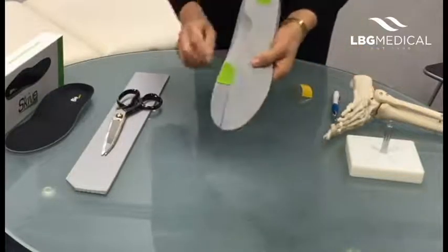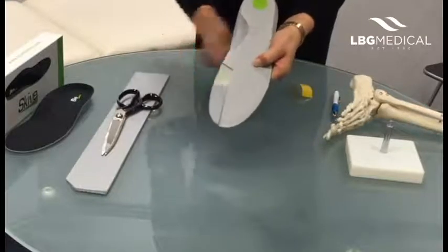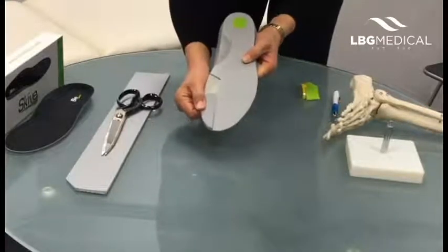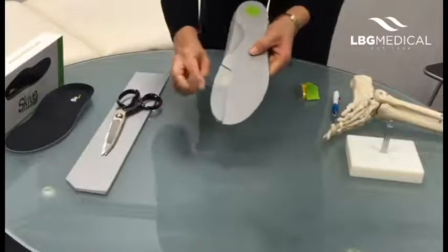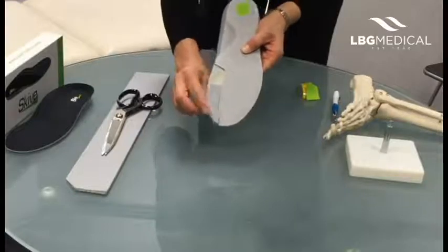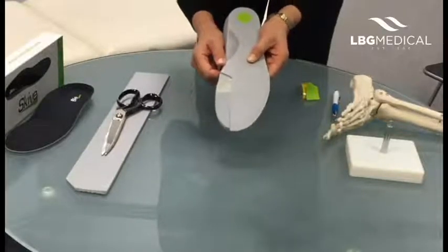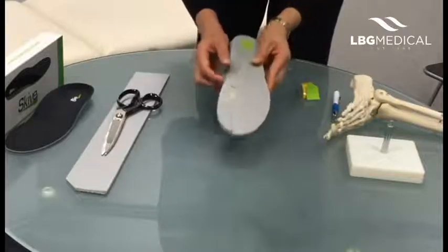The good thing about this device is that we've got a removable metatarsal plug, so I'll just take that out. If you've got a patient with functional hallux limitus, you've got the distal post to help engage the windlass mechanism, and then we've got the spot there for the first MPJ to drop down into — and that's really helpful with patients that have this condition.